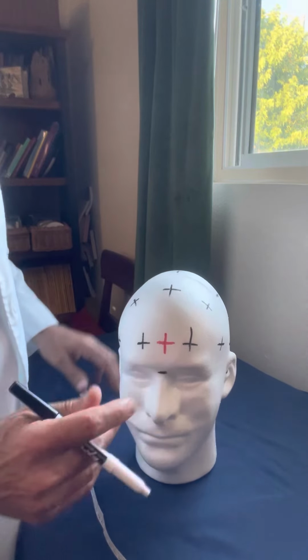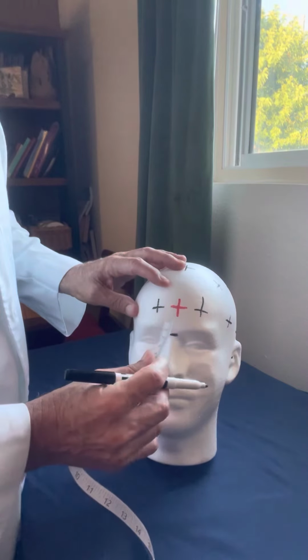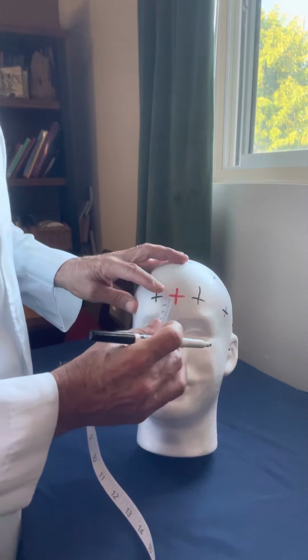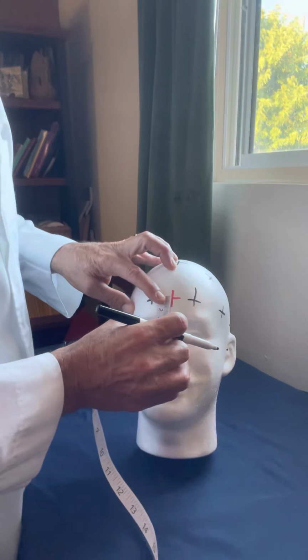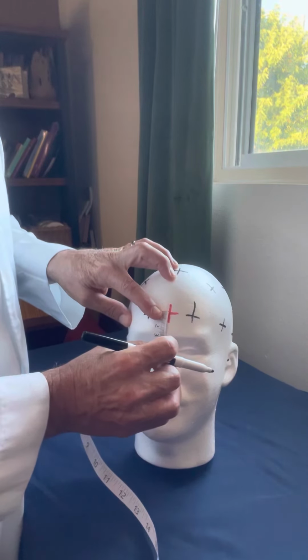If the distance is 35, the distance from the nasion to FPZ should be 3.5 centimeters. If I measure that, it's exactly 3.5 centimeters.